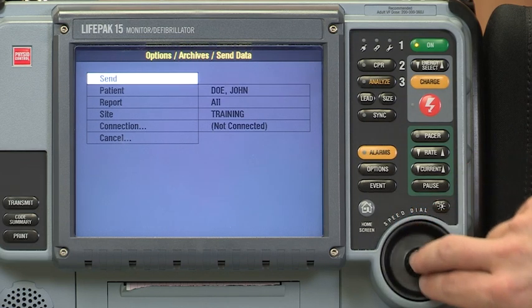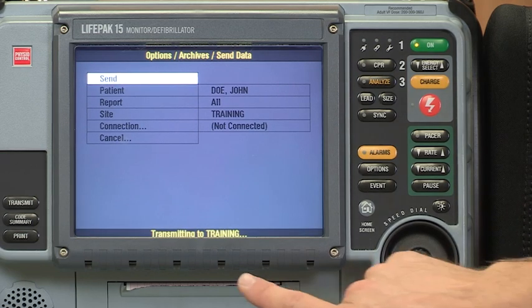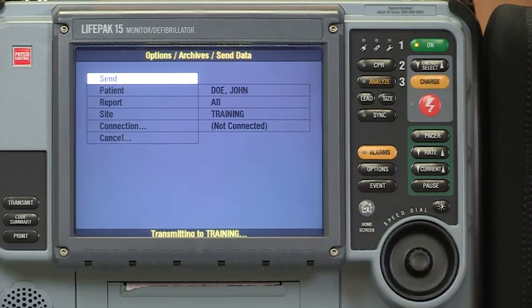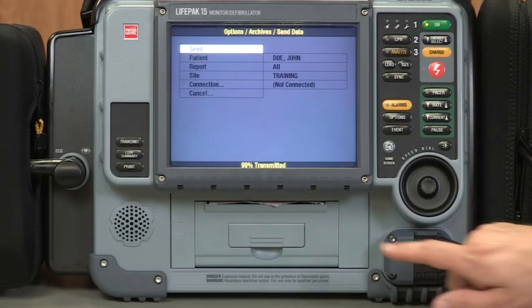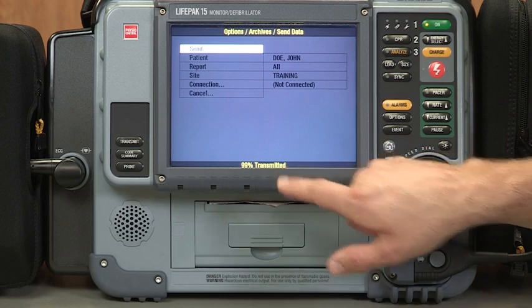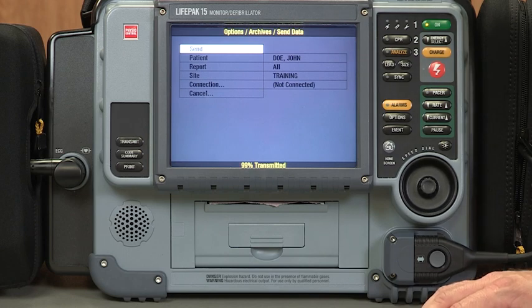Scroll back up to send. Select that from the speed dialer. And down here you'll see it's attempting to transmit to training. It says it's transmitting to training. Okay, now you'll notice that it stopped at 99% transmitted. That's where the machine is finishing up its last little bit of the transmission. And it'll stay here for a few seconds. And then you'll hear a series of beeps once it's completed its transmission.